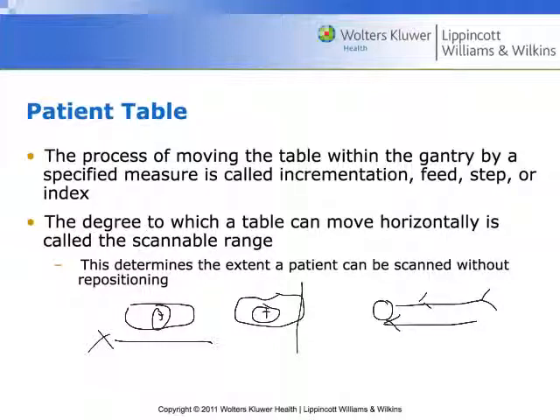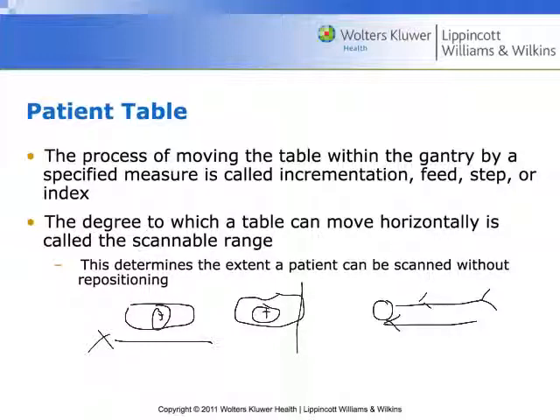I'll set an isocenter — a zero point — zeroed along the X, Y, and Z axes. I'll make sure the patient is adjusted left to right and up and down appropriately, advance them into the gantry aperture to the correct Z-axis position, then hit zero. All movements will be relative to that point. This is especially important for CT special procedures, because you can set a zero point and make measurements in any direction from it.